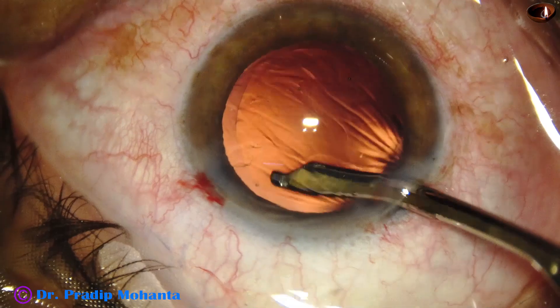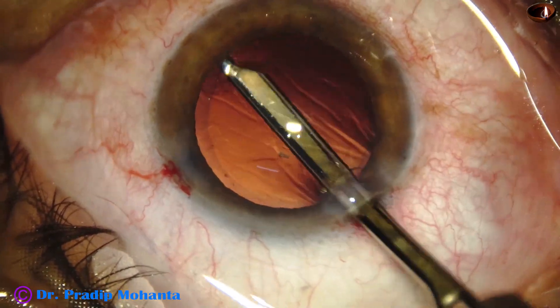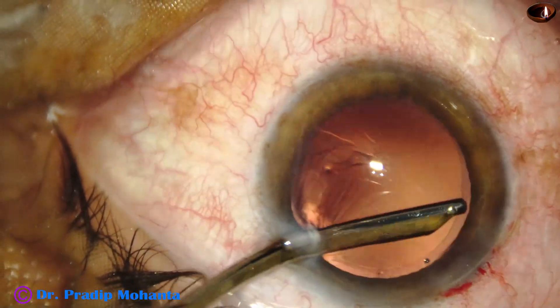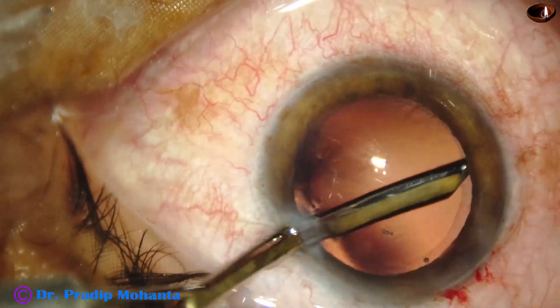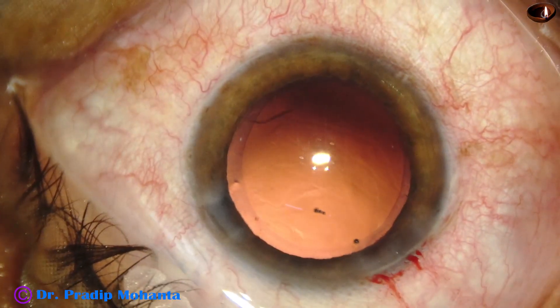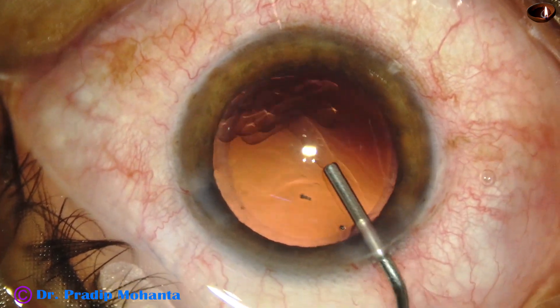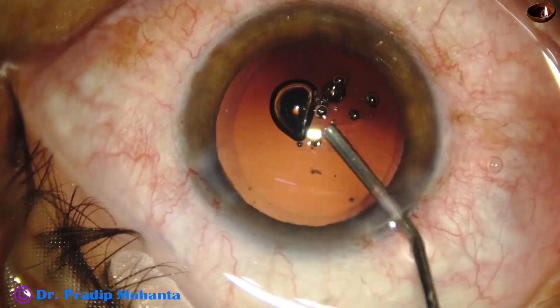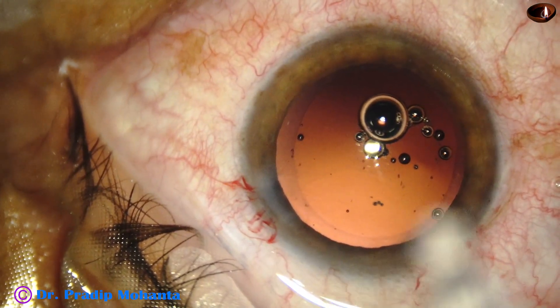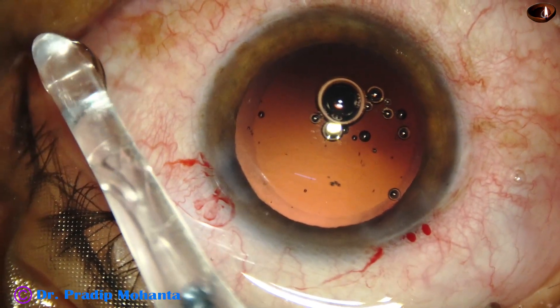A little bit of cortex was there — it was removed — and now planning to implant the intraocular lens. The cortex has been nicely removed and the chamber has been filled up with visco. I did not do hydro implantation in this case. And now here goes the intraocular lens.